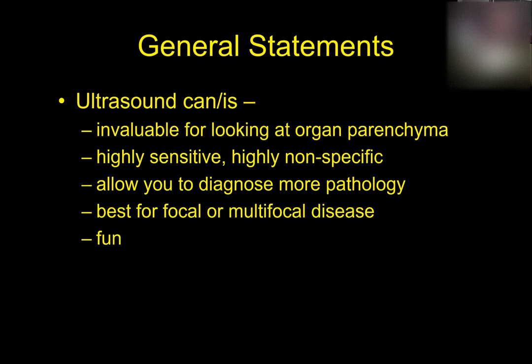And there are some examples of disease processes that can do that, such as mast cell disease or lymphoma in the organ of the liver or the spleen. Sometimes it affects the entire organ. That organ is diseased, but it looks sonographically pretty normal. So just because you ultrasound the spleen or the liver doesn't necessarily mean that organ is really normal.